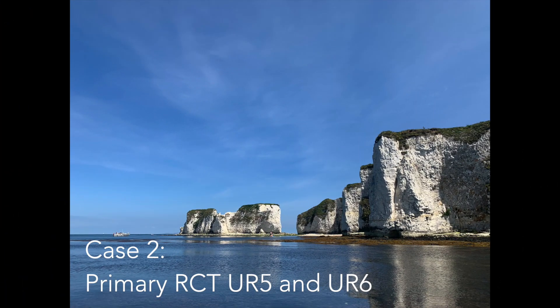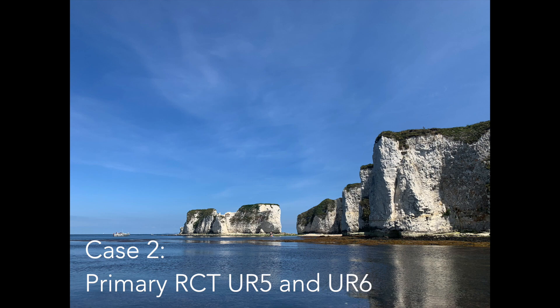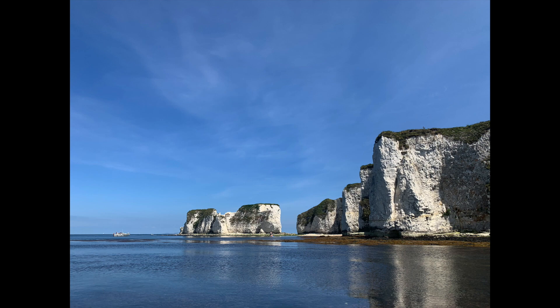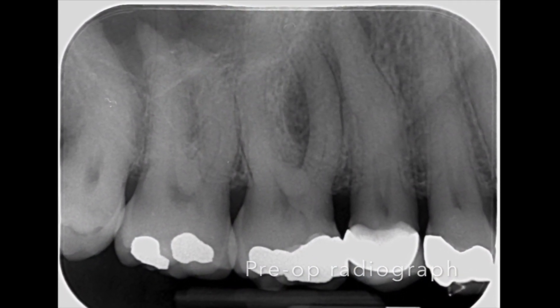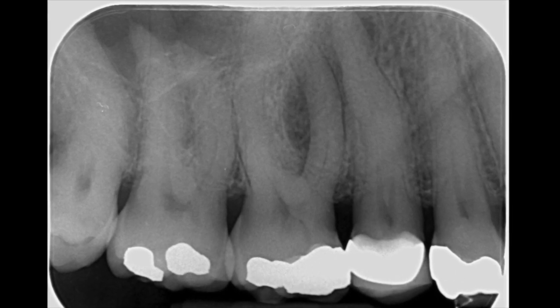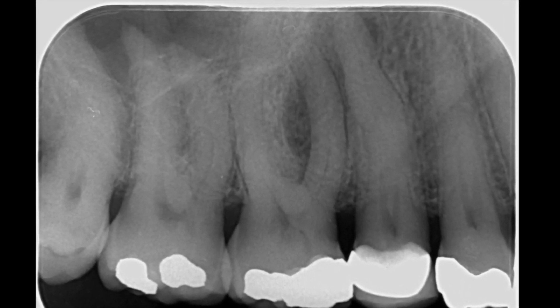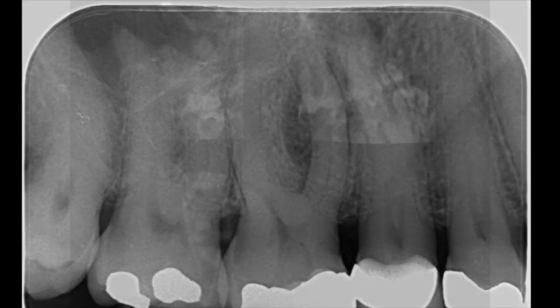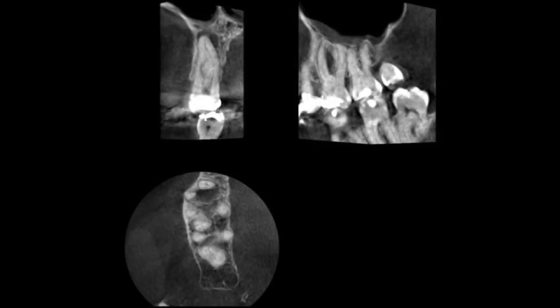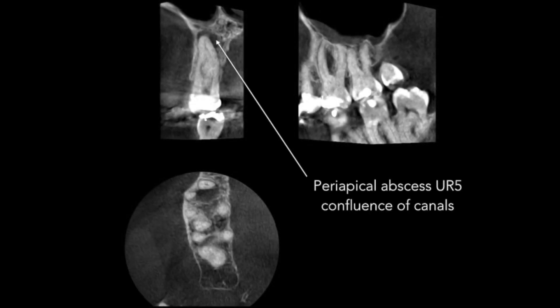On to case two now, and this is a maxillary first molar with very long roots and calcification in the pulp chamber. The preoperative radiograph shows the maxillary right first molar. The tooth is restored with an amalgam and has calcification in the pulp chamber. A CBCT clearly shows periapical radiolucency. The tooth is going to need root canal treatment.